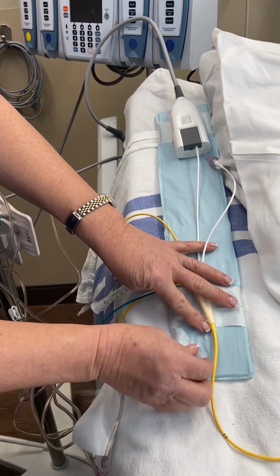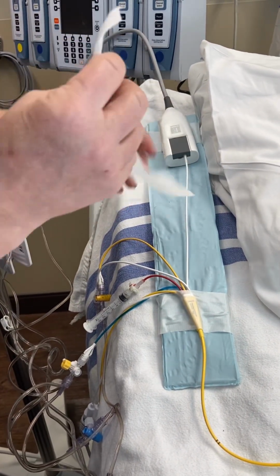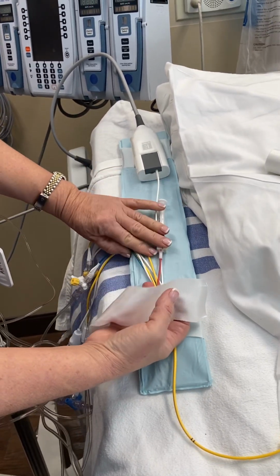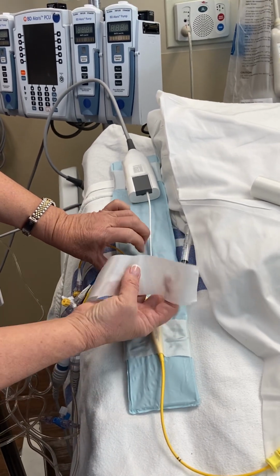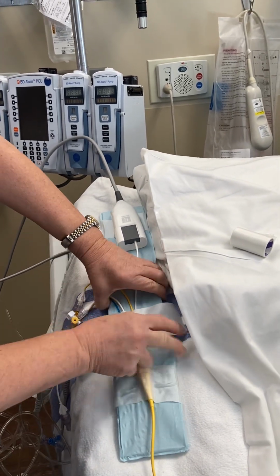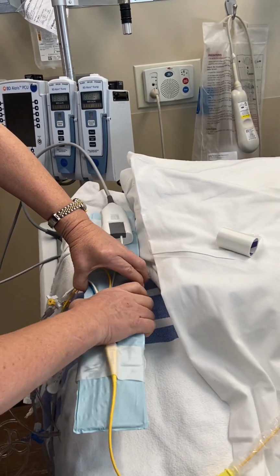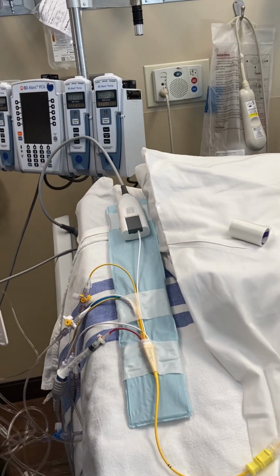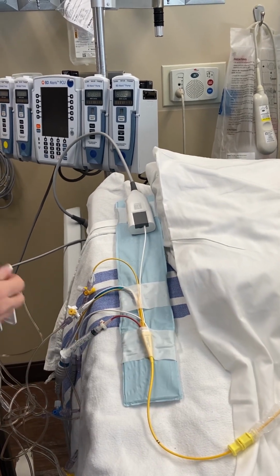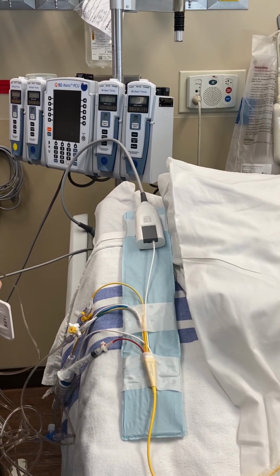So on to our third piece of tape. You keep your infusion port and your little balloon line out as well. So you just kind of tape it across the top, kind of just like this. That's kind of left out, and this is kind of left out. And this too just basically holds your lines and stuff in place. And that's how you tape. That's how the Swan should be taped. It shouldn't be taped to the bed. It's nice and neat. You're able to see all your lines and cords, and that they're appropriately secured on your arm board.